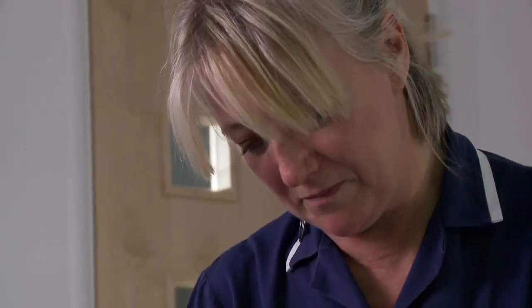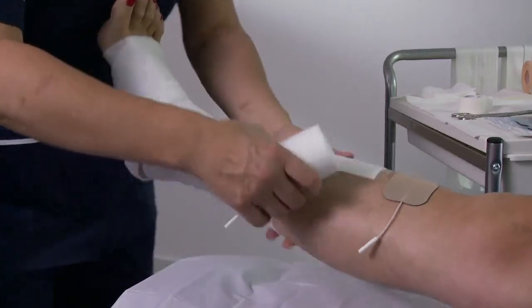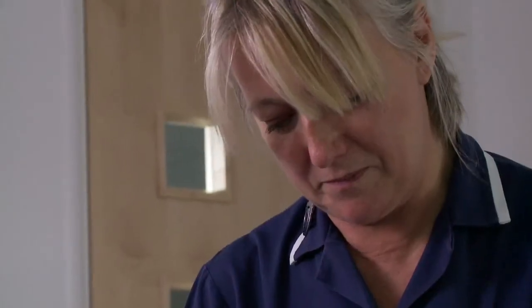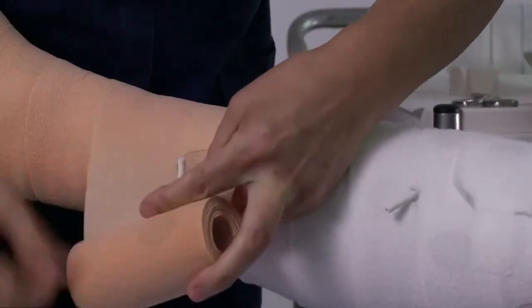You can now proceed to apply the soft ban, ensuring that the electrode wires are not in direct contact with the skin but fed through the bandage to avoid any pressure injuries. You're now ready to apply compression.